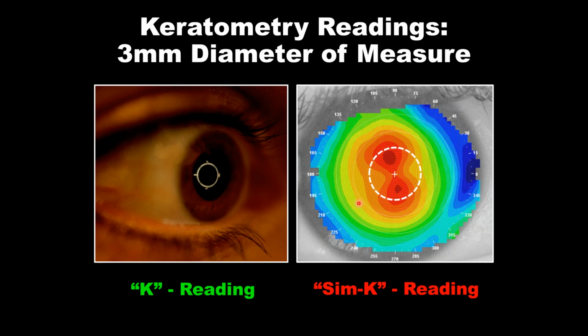And this is helpful when we have a normal, regular cornea. But when we have any kind of irregularity, or when we're constructing a large diameter, a more irregular type of shape, such as an ortho-K lens, it's not so conventional, being flat, steep, and flat, or reverse geometry and shape.